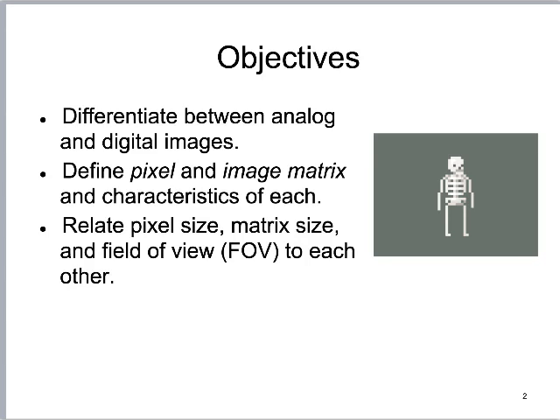The name of this lecture is spatial resolution. The big umbrella term is resolution, and it basically means, can I see it, yes or no? Underneath it, there are at least two subdivisions. There's spatial resolution: can I see it in space?